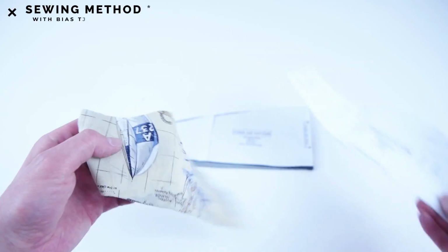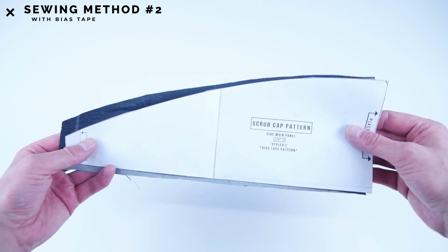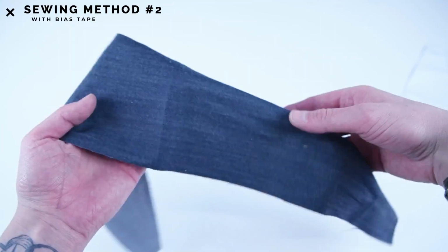Starting the second technique, you'll need one top main panel cut on the fold. One side main panel also cut on the fold.